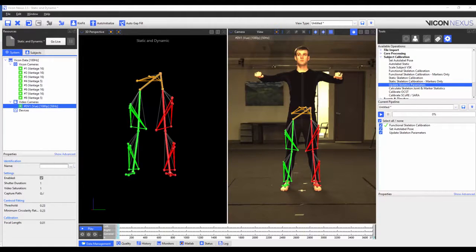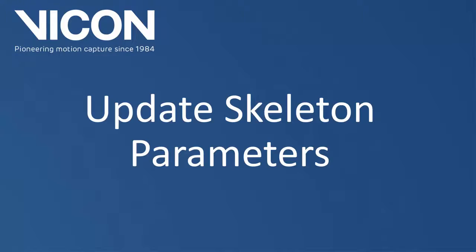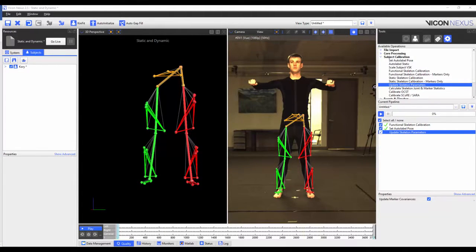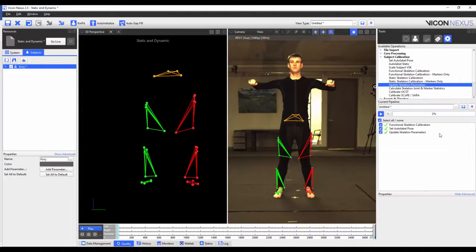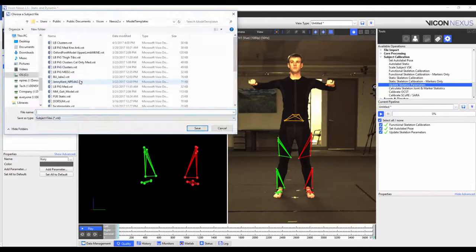Now I'm going to go to a frame where my subject is standing in the base pose and run the set autolabeled base pose pipeline operation. As the name suggests, it is the pose that the autolabeled static pipeline uses to properly identify a cloud of unlabeled markers. To use these joints and marker statistics for the VST, you must update the skeleton parameters and then save. I'm going to run the update skeleton parameters pipeline operation, making sure that the update parameters button is checked under the advanced properties. I'm now going to overwrite the VST I had previously created by right-clicking on the subject name, saving the labelling skeleton as a template, and overwriting the previous template.